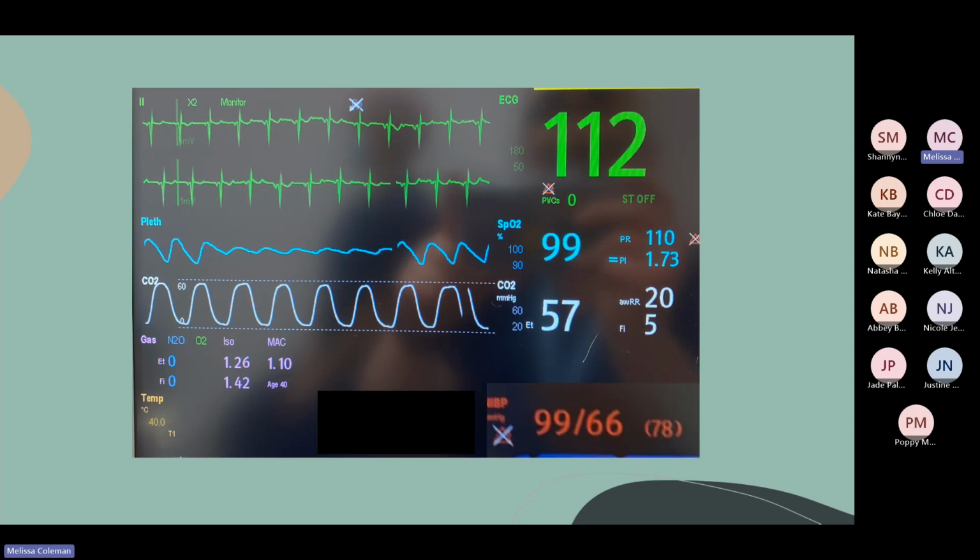And then our next blood pressure reading is a mean of 78. She's stayed stable. She hasn't reacted at all, but her blood pressure stayed stable on 1.25. So then she goes out for the rest of the GA and we don't have any issues, which is great.